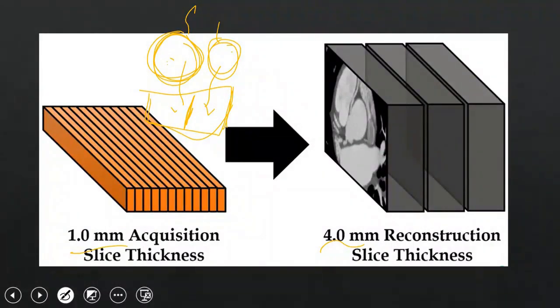So the solution is to reduce the thickness so that you can see the slice that contains 1 and the next slice that contains the other. This reduction helps improve the situation, but it will increase the amount of data you have.